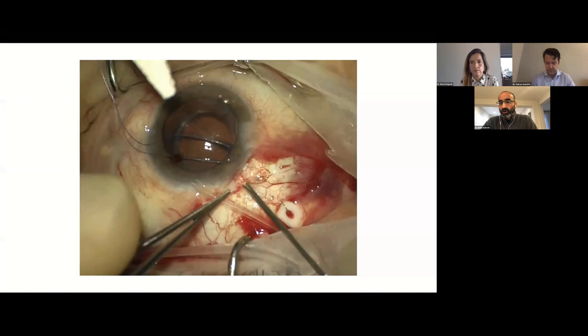How far you go away from the limbus for your entry is extremely important. If you're closer than 2 millimeters, that's going to be a point where you're going to get erosions. And we've had a couple of questions about how we handle conjunctival erosions that we'll try and get to towards the end here. One of the things that I learned in traveling was the Z technique for entry that Felix Heel taught most people in Central South America.